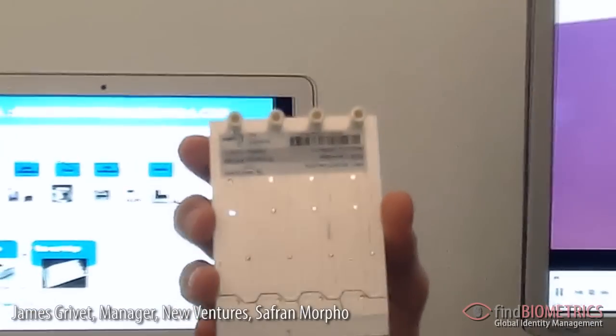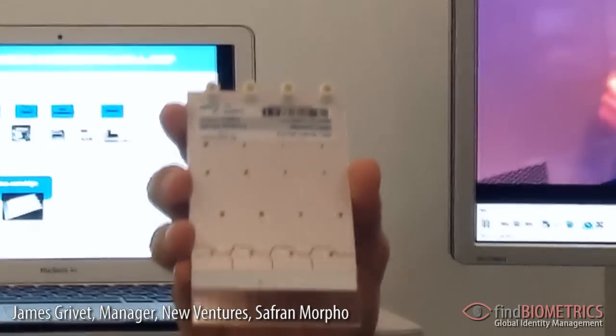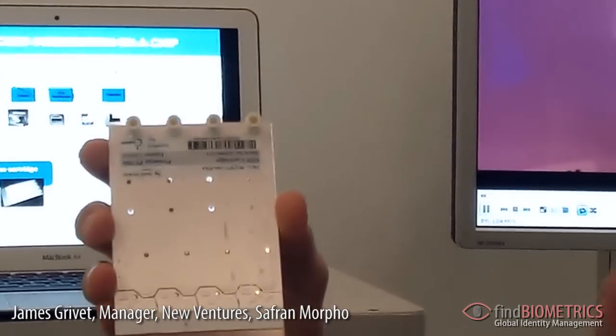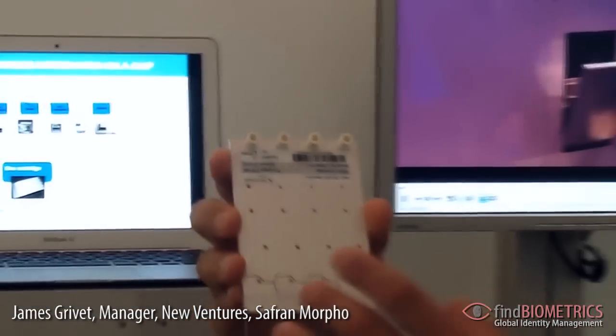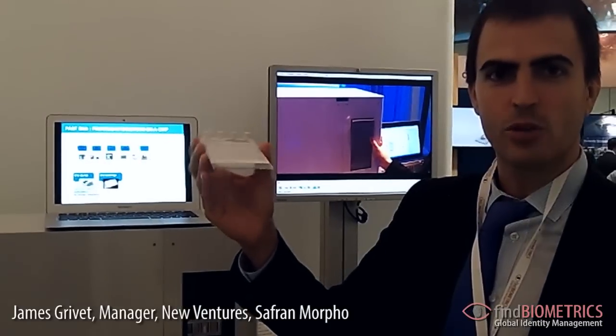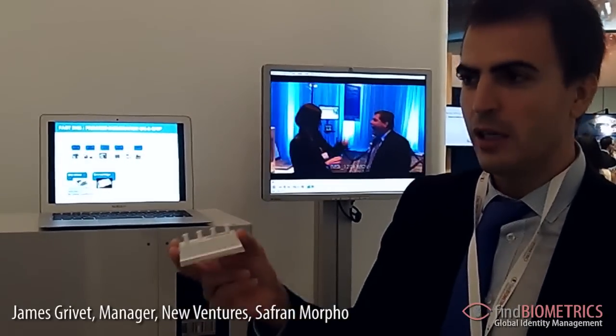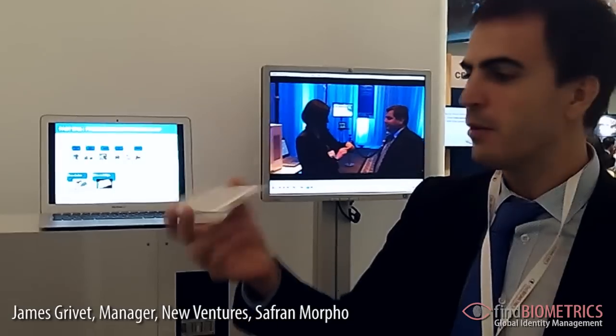Not much larger than that. In that cartridge you have all the steps of DNA analysis, from extraction to separation, and all reagents are embedded. So it's a very secure, very closed system, and easily manageable by a person.